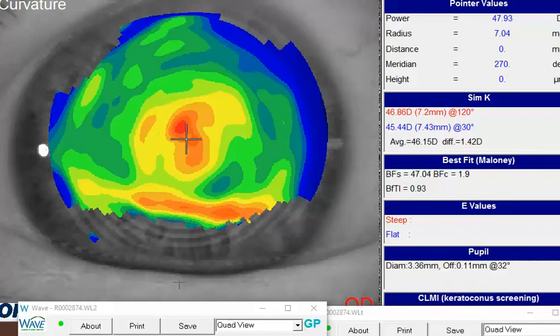I see from your clinical request that these lenses are riding high and fitting rather tightly, probably keeping them from translating down where they need to center. So just a couple of general thoughts looking at your topography. As you know, we're missing a little bit of inferior corneal data due to the lacrimal lake here. Just a reminder, try to keep those topographies as full as you can to maximize the fitting data that you have to work with.